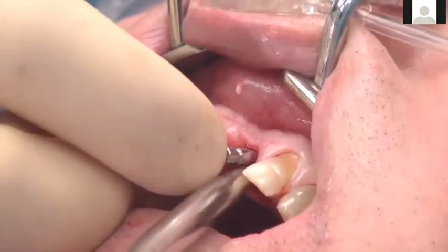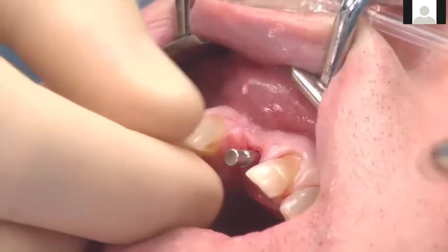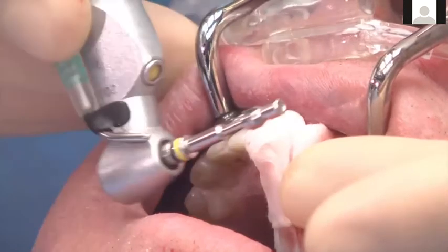Now, sometimes those Straumann depth gauges have got that round top on them, so you can use some depth gauges from Straumann that don't have that round top on them to measure it if you're doing it flapless.